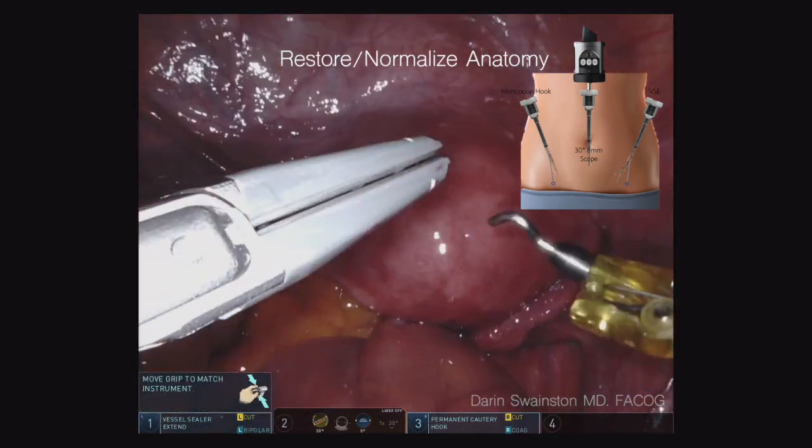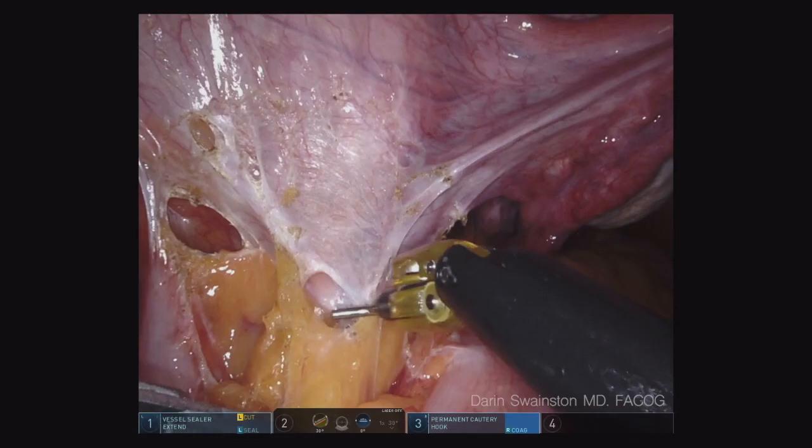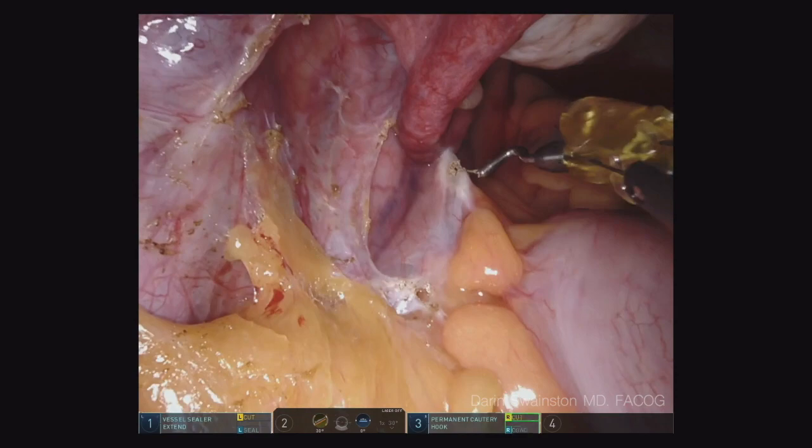This is an updated video of what I do during a typical hysterectomy where there's also a pelvic organ prolapse. The first part is a adhesiolysis. I always try to restore normal anatomy before I get started with the hysterectomy, especially when I want to know where the ureters are and I don't want to incorporate them with the uterosacral ligament suspension.